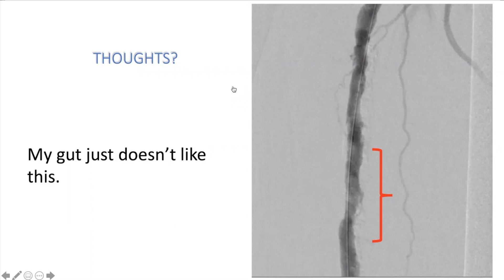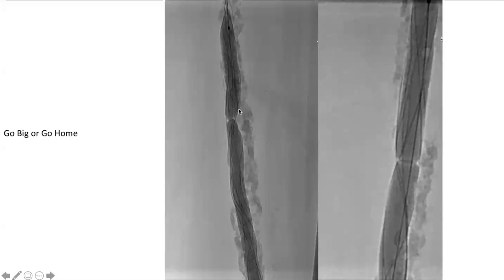Be careful because you can cause perforations and pain — watch for those. If the patient is having pain, stop. But doing a little CSI or Hawk atherectomy at those re-entry zones of a CTO may be helpful. After ballooning this patient, I didn't really like this area — just a gut feeling — so I used the AngioSculpt 7mm and you can see there was a waist that finally expanded.